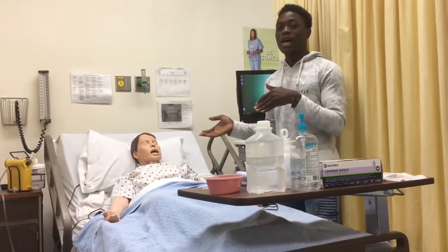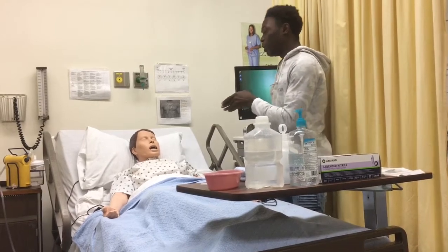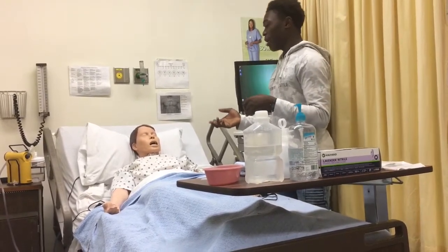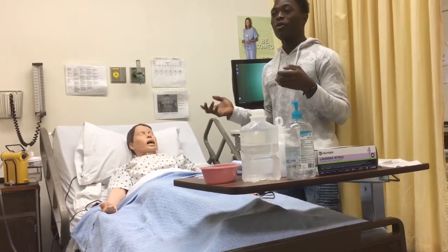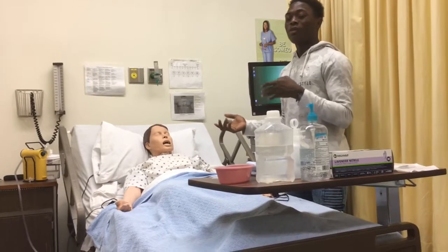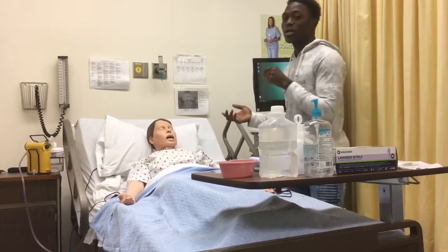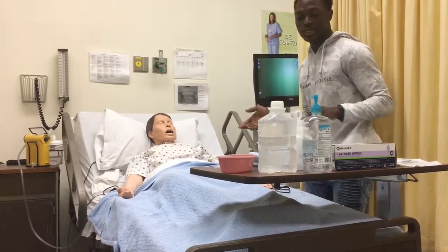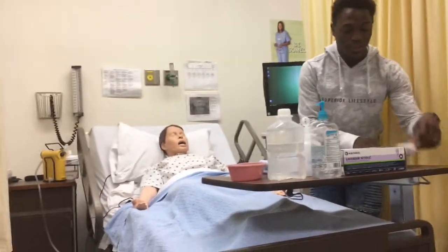Like if your patient has a nose trauma, or if they have a broken nose, or a tender nose, which is another contraindication. You don't want to do it then, because you can poke a hole through the nose that can cause continuous bleeding. So I've already selected the nare I'm going to insert the tube in.